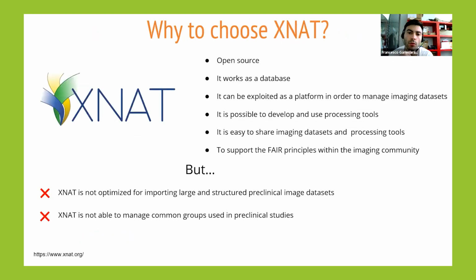So we decided to use XNAT for preclinical imaging centers. But why choose XNAT? XNAT is an open source platform, and it works as a database. And XNAT is an imaging platform for managing and sharing imaging datasets. And we have the possibility to develop, use and share processing tools. And XNAT supports the FAIR principles.